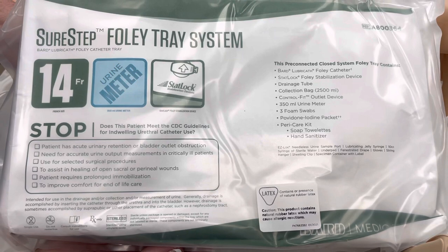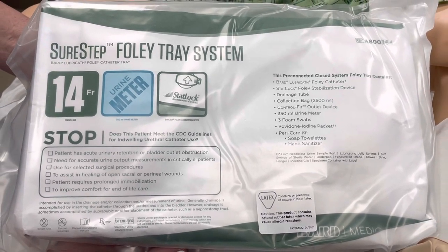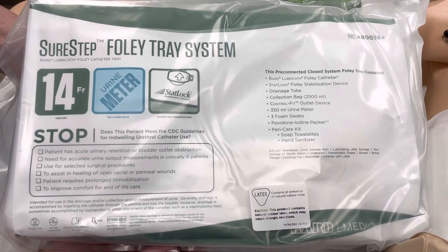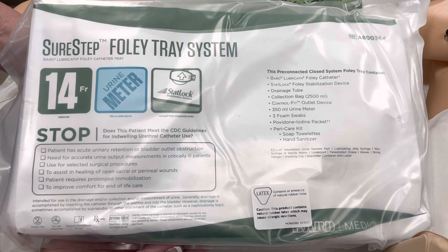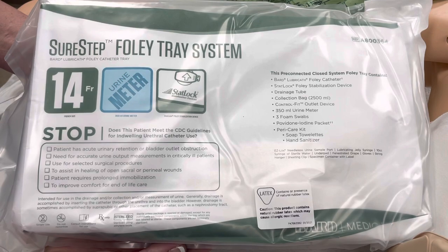The first thing we're going to do is verify the order, get our supplies together, and educate the patient on what we're about to do so that they're aware of the process. You do not have to have a consent for this procedure. However, it is our policy that we insert a Foley with two nurses so that we have four eyes to help maintain our sterile field.